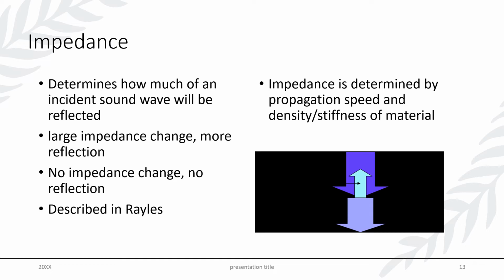Okay. Now, we've already basically brushed on something called impedance, which we represent with the letter Z. Just like in everyday life, if you're impeding traffic, you're resisting it or causing a problem there.